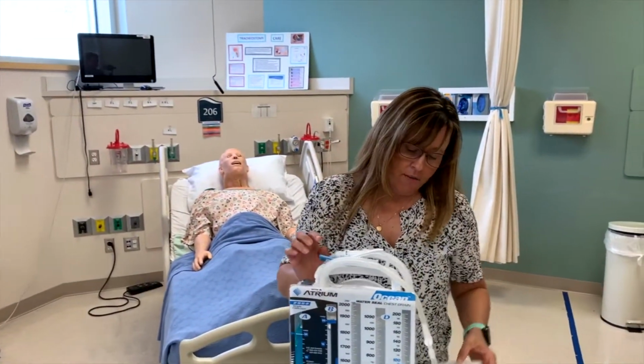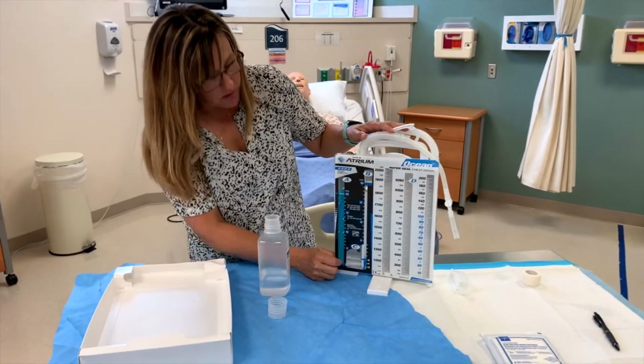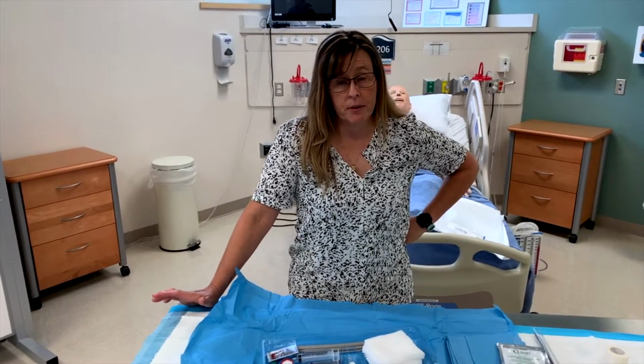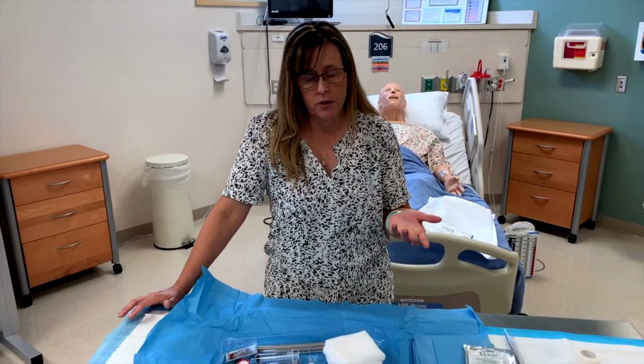Okay, now we have our stuff hooked up. We got our water seals filled. Now it's time to watch our doctor put in that actual chest tube. Okay, so now it's about to get insertion time here, and so let's go over just what you're going to expect to see when they put in a chest tube.